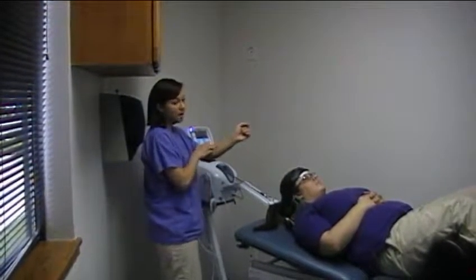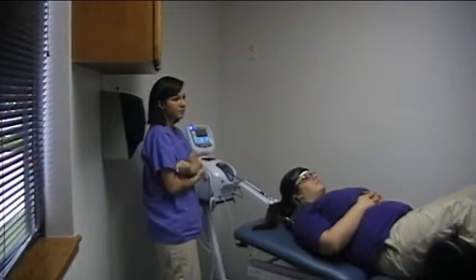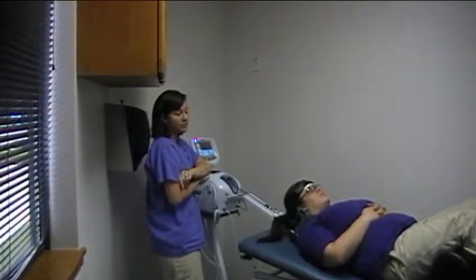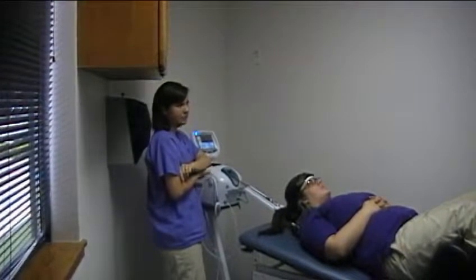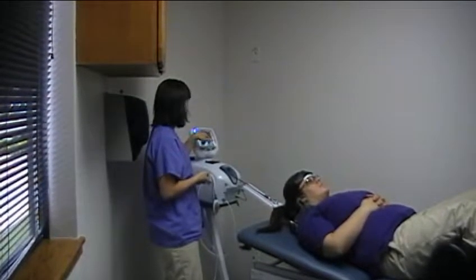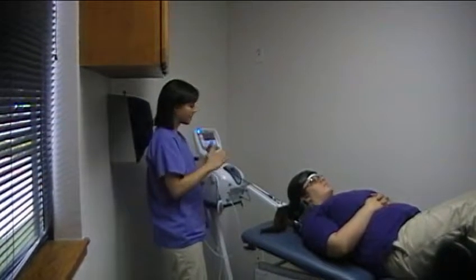If you ever stop a therapy early, the machine won't ask you if you want to save — that only happens if you let it run through the entire cycle. Once you do stop a therapy, wait until the pounds are down to zero before taking the patient off.